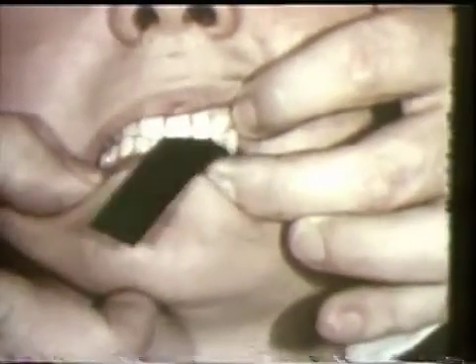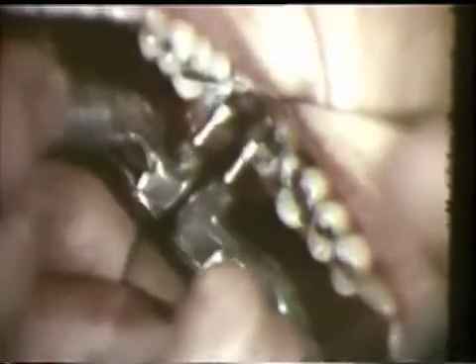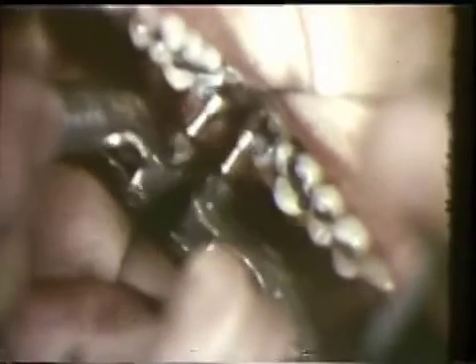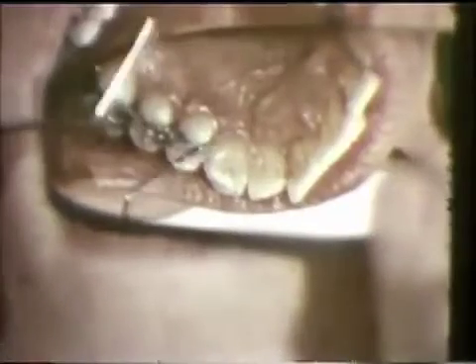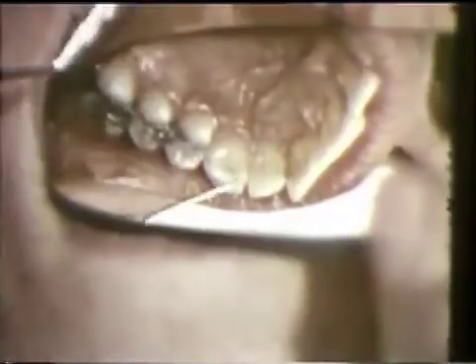Carbon paper is used to mark these contacts in the mouth, first for the balancing and then for the working side. The grinding is done on the buccal incline of the lingual cusp of the left maxillary second molar. Grind with an inverted cone stone and leave a holding contact on the tip of the cusp. The ledge on the right cuspid, responsible for the jerky movement, is ground slightly to provide a smooth guidance. The initial and end contact on the cuspid are left undisturbed.